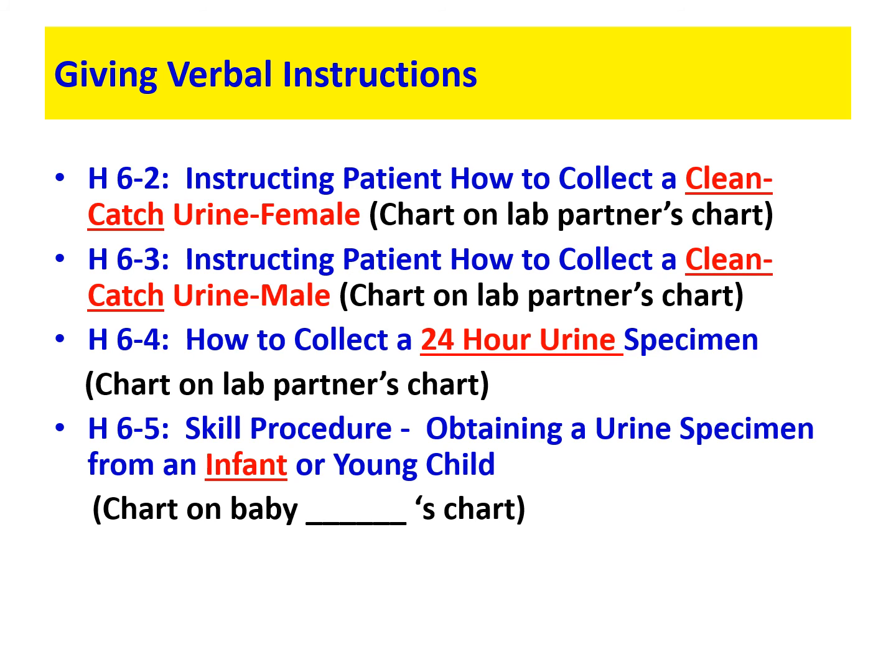When you come back, a lot of times you will open up the baby's diaper, and hopefully there will be urine in the bottom of the plastic that is connected to this device, okay? It's like a little bag. So then you can gently take it off of the baby, take the urine that is in the bottom of the plastic bag now, pour it into a urine container, put the top on it really well, and label the urine container with your baby's information, okay? Now, you can either instruct the parents how to do this and they can take it home, or sometimes it can be done in the doctor's office.